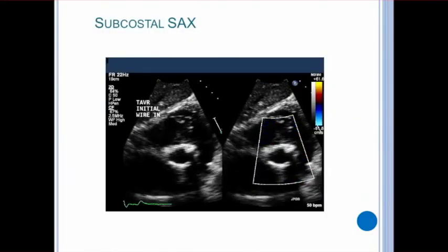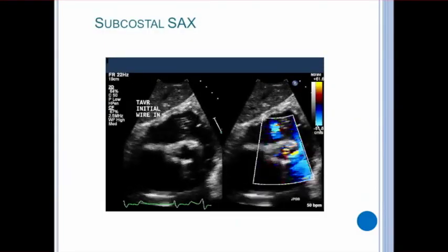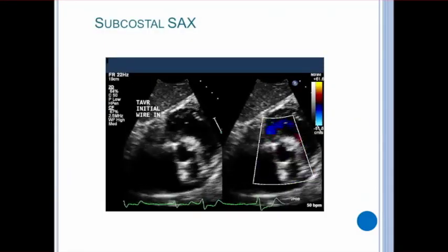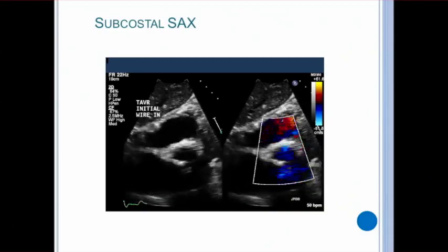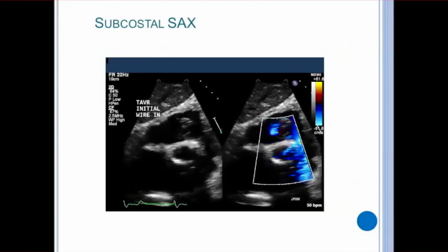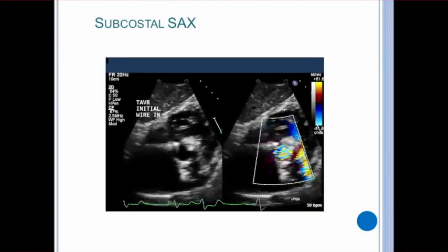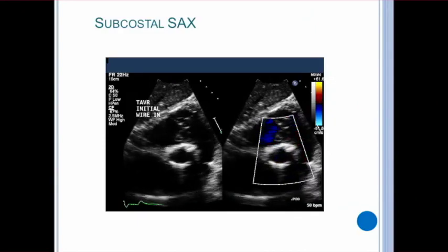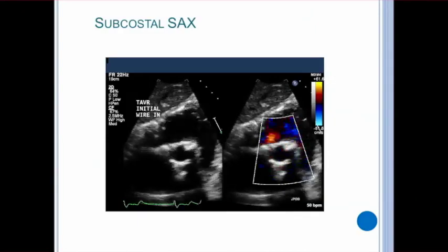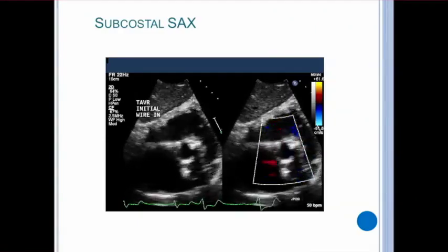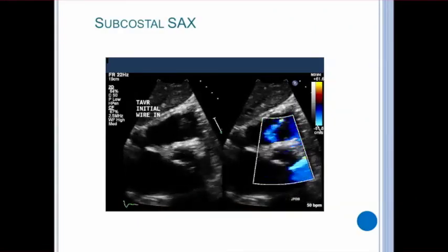In addition, for patients who have more challenging or lower imaging windows, you may want to try the subcostal short axis to have a better look at the aortic valve. Try to think outside of the box when interrogating, like using the right sternal border to get a different angle on the aortic valve.